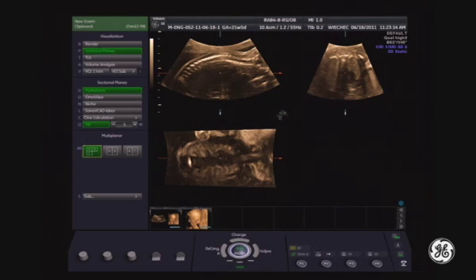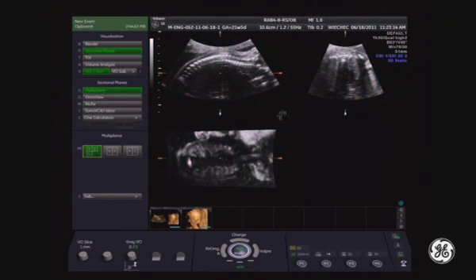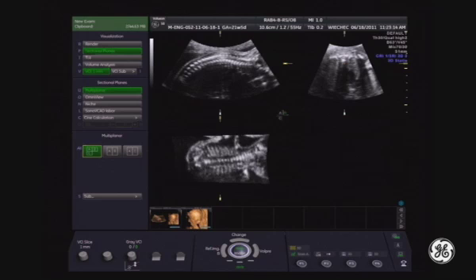I will make some orientation. To do that I will use the line of the spine in plane A and in plane C. I will select Volume Contrast Imaging (VCI) to enhance my B and C planes. Then I will bring the pivot point in the reference image B to the level of one of the fetal trunks.